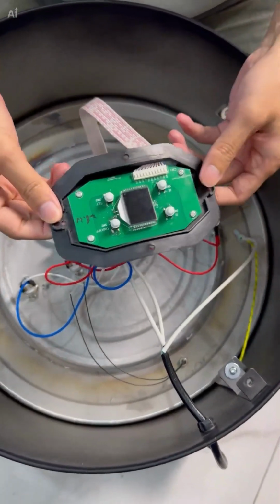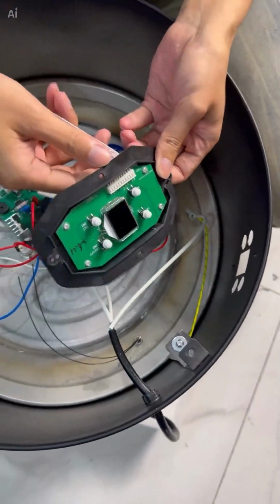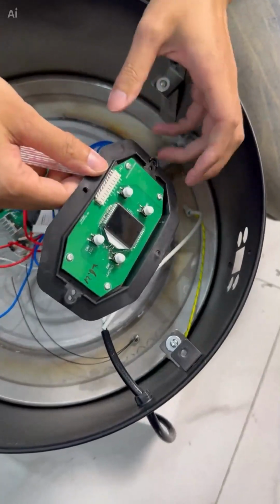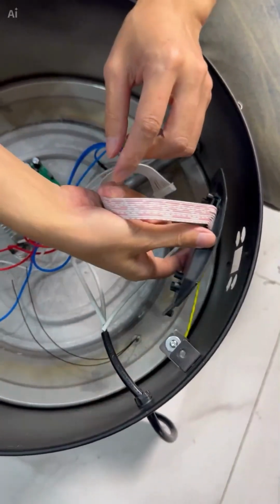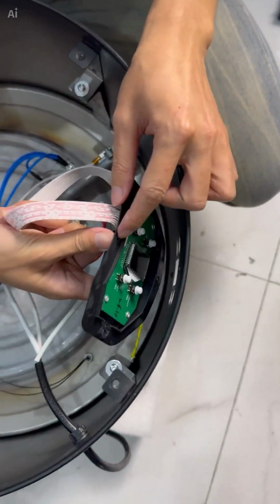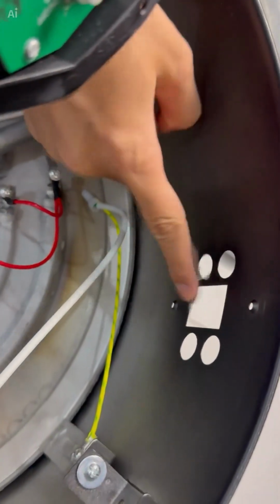The next step is to put this plastic shell back in its original position, and the installation has a specific direction, so you need to pay attention to the direction. Reinstall this ribbon cable facing up back to its original position. Then you need to align this hole with this hole. The 2 holes on the plastic shell need to be aligned.